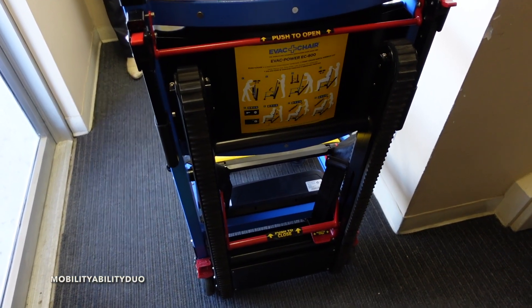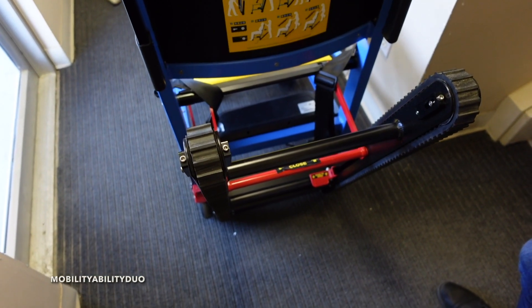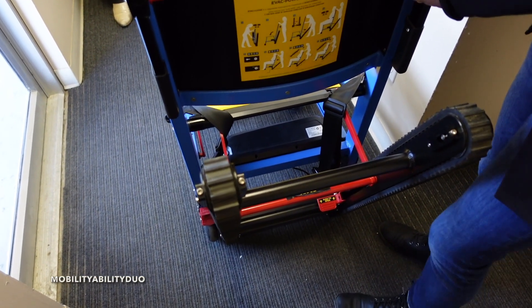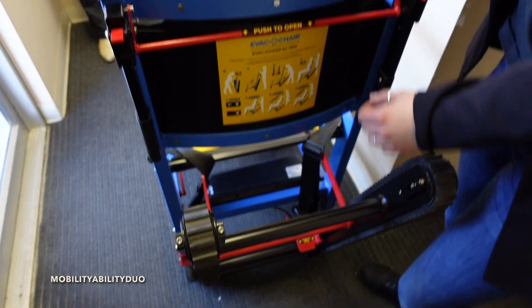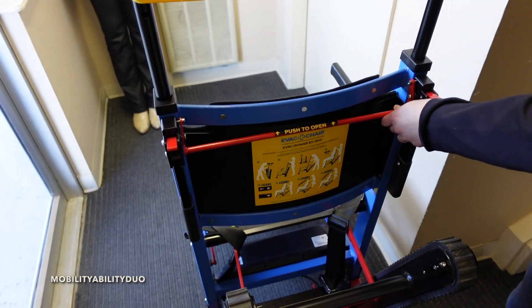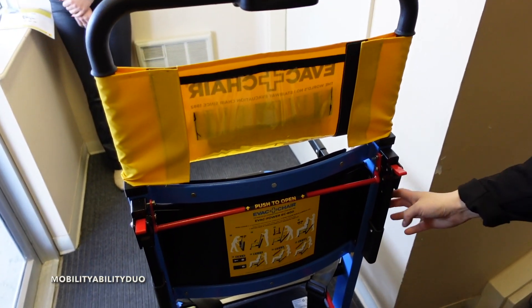Take the brakes off and then wheel to the step. The power controls are pretty straightforward - you've got down, power, lights, and up. There's a little gauge telling you where your battery is, and there are lights as well. There's a battery running this. You can actually lock the armrests. The battery slides out so you can slide it out, and you can see where the charger goes - you just charge it right there.